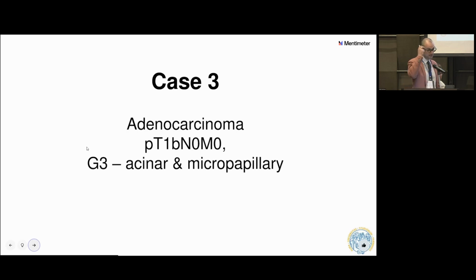So some of them might not be clinically relevant in the face of comorbidities that we might have for those subjects. And the morphological interpretation, just beyond the size, going to the density change, but also morphology, might somehow help. And the concave sign is associated with higher risk of infiltration, if you want. So at this point, I'd like to ask also our panelists what would have been their management for this nodule. And we go with a pattern proximal to distal, if you want.